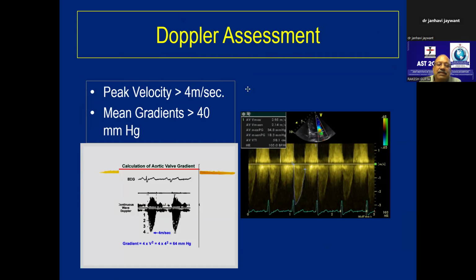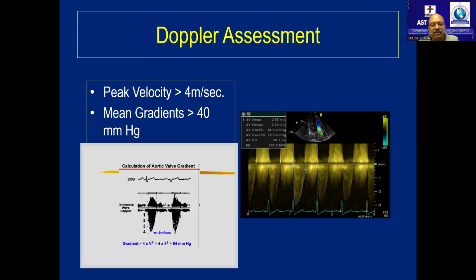Sir, only in case of aortic stenosis? Only in case of aortic stenosis. In normal circumstances, whether pulse wave or continuous wave Doppler, it will be almost the same because there's no stenosis. Whatever blood goes through the LVOT has to pass through the aortic valve. The doors are wide open. Sir, if your aortic valve is normal, then you can use pulse wave at both sites. You can. You should.